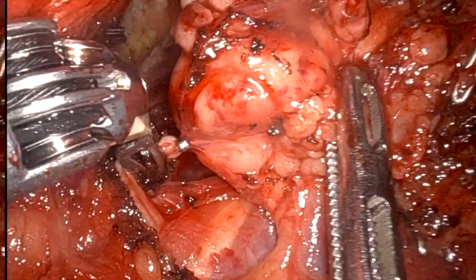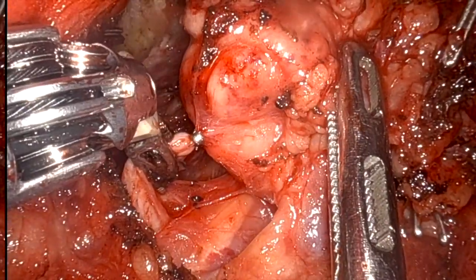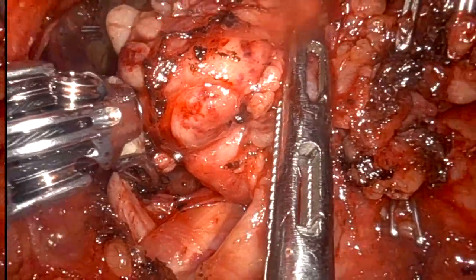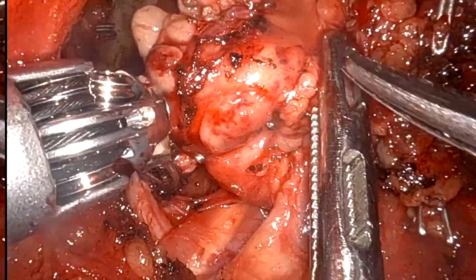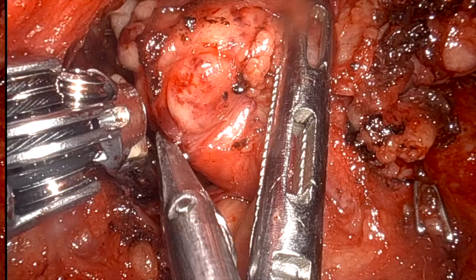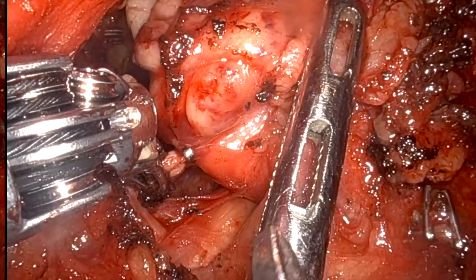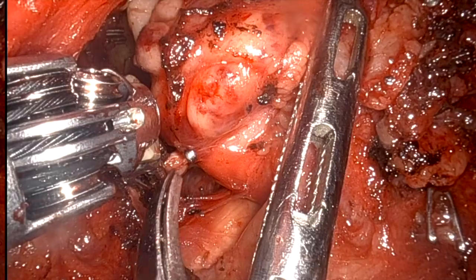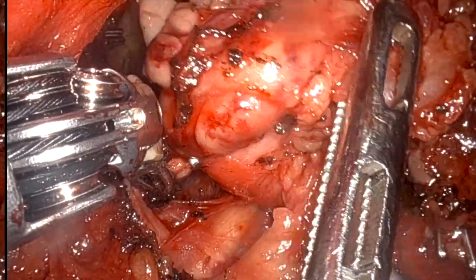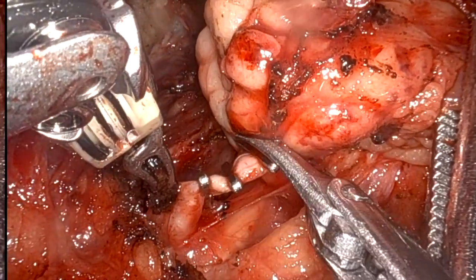Always put two clips at the patient side for any artery while clipping. This is very much important. While I am holding this specimen in the artery, my assistant is cutting with scissors. Don't confuse this with a third robotic arm. This is scissors and this cutting is done by my assistant. Believe me, this is not that easy, but he is trained enough.